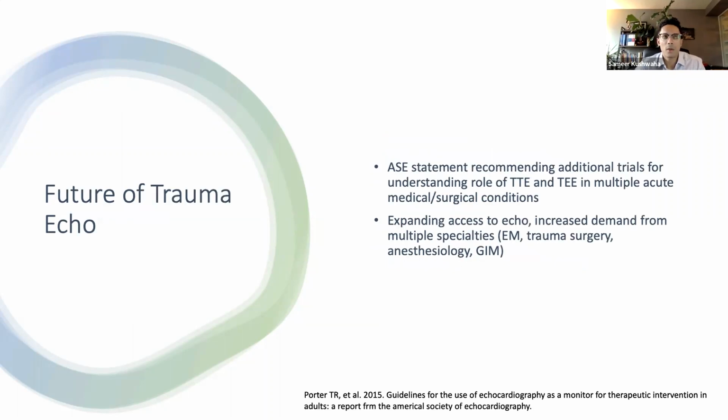I think there's going to be an increasing role of echo in trauma and in resuscitation in general. Recent ASE statements have come out recommending additional trials to understand the role of transthoracic and transesophageal echo in multiple acute medical and surgical conditions. And I think there's also increasing demand from physicians to learn about echo from multiple specialties such as emergency medicine, trauma surgery, anesthesiology, GIM. I think there's a lot of applications of echo, and we in cardiology will also play an important role in educating other people about how to use echo and how to interpret the findings.